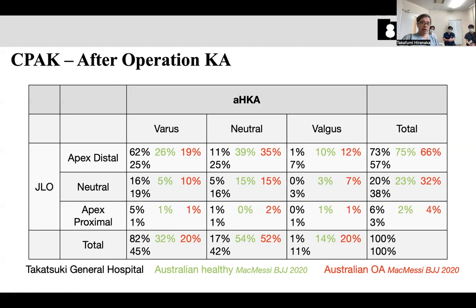If I truly performed true kinematic alignment, this distribution should be similar. But I corrected a little bit, especially on the tibial side. I reduced some MPTA, so that shifts the alignment distribution to be more neutral. Anyway, it is very beneficial to compare the preoperative and postoperative distributions, and at the same time to compare the distributions between races.